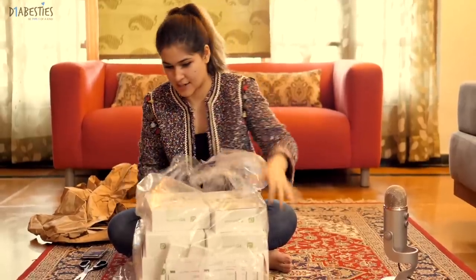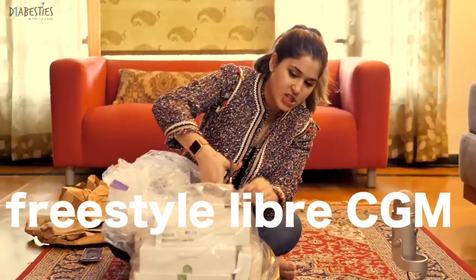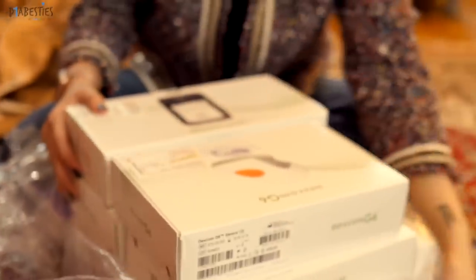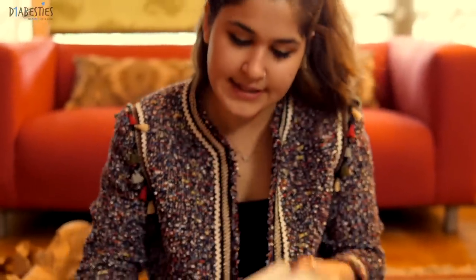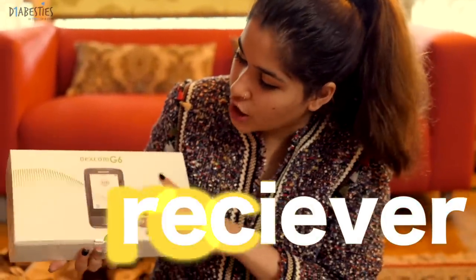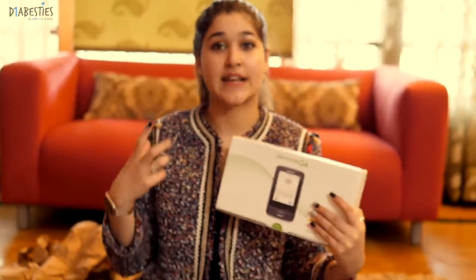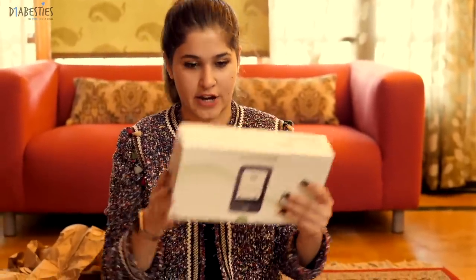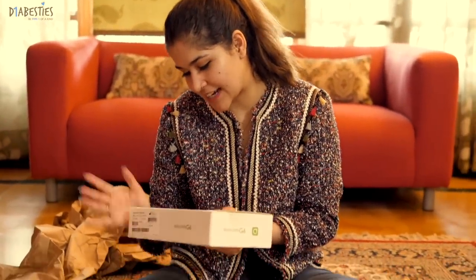I've never used the Dexcom before. I use the Freestyle Libre CGM, which is a good alternative for the Dexcom. So what we have first is the Dexcom package — it's the receiver. So this is called the receiver, and it's a little device that has all your readings and records. I don't know all my research about it yet, but it's very cool — it's like a touchscreen.